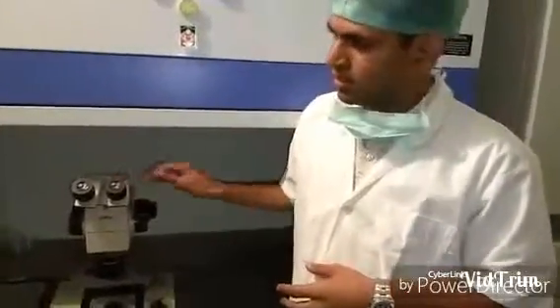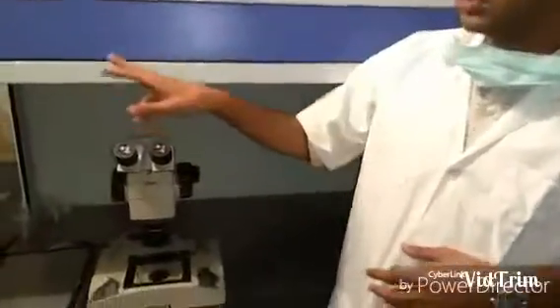Everything is done under these microscopes. That is the reason this microscope is kept under a laminar flow hood cabinet, to ensure that we maintain sterile conditions when we are performing the procedures.